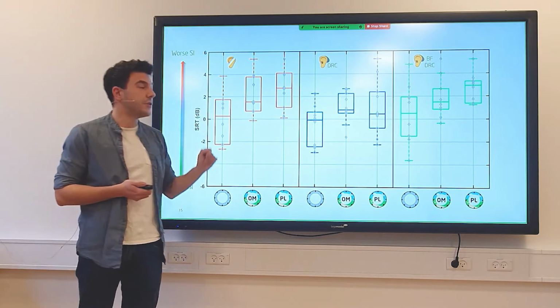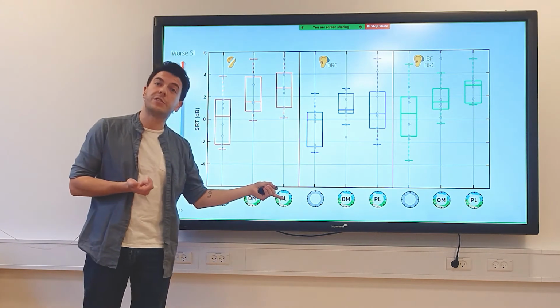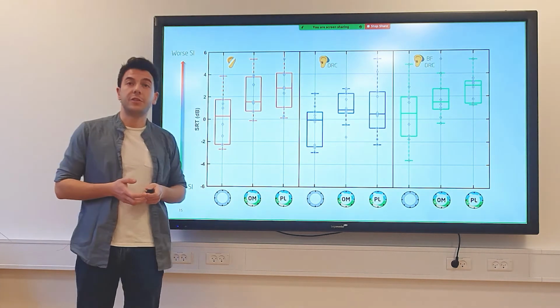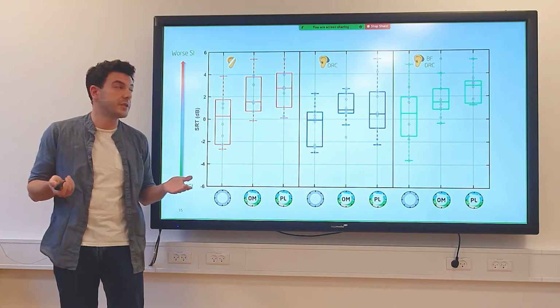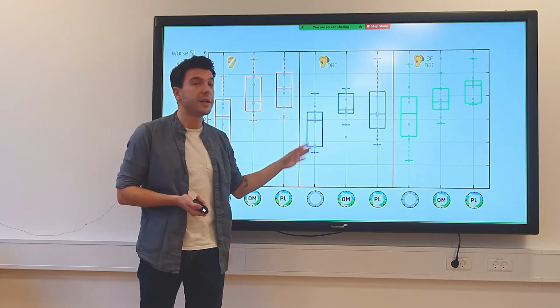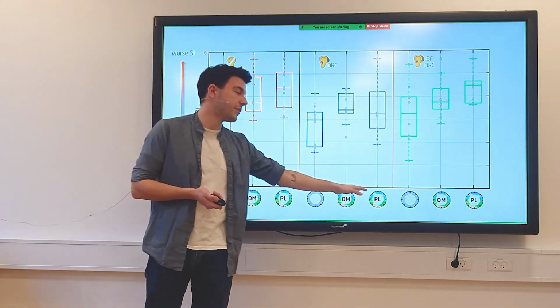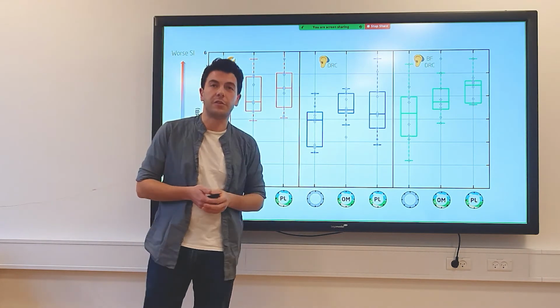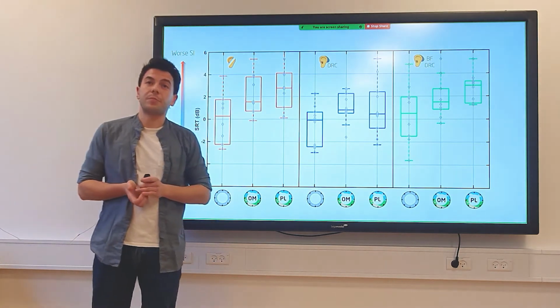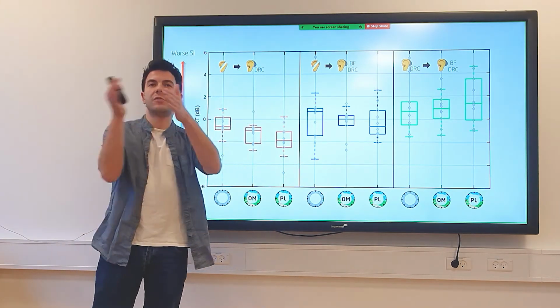If you look at the box plots in red here, you see that the 2 results distributions corresponding to the realistic VSEs are significantly increased compared to the artificial reference for the unaided situation, which is what we saw before in the first experiment. However, this also carries over to the other 2 strategies. So when aided by hearing aids, people still have elevated SRTs, or poor speech intelligibility, in the realistic VSEs compared to artificial conditions. In addition to that, the results are also quite spread out over participants, which is why we also looked at differences within one participant when moving between one strategy and another.